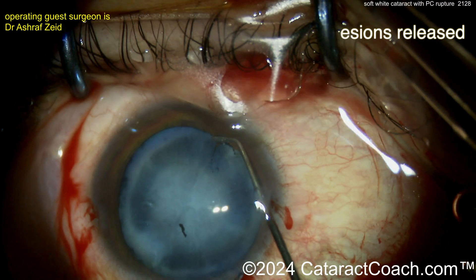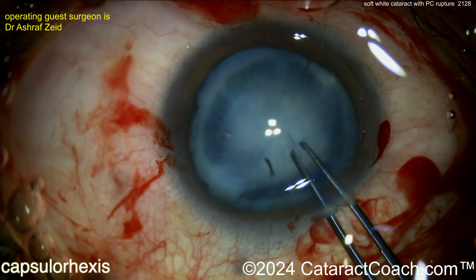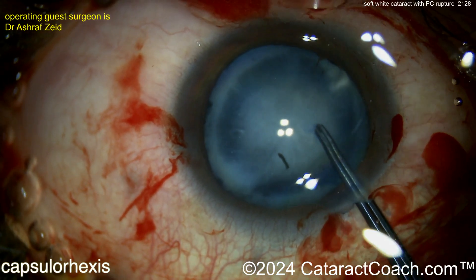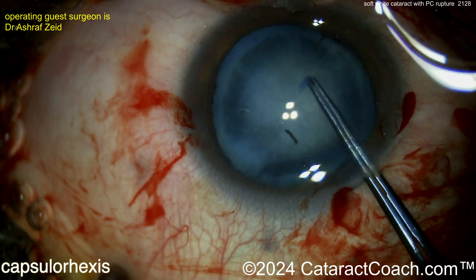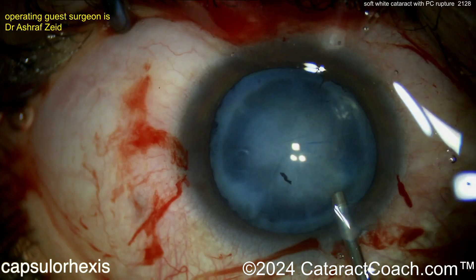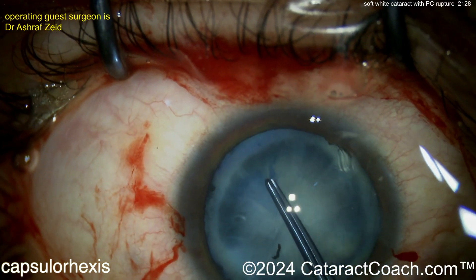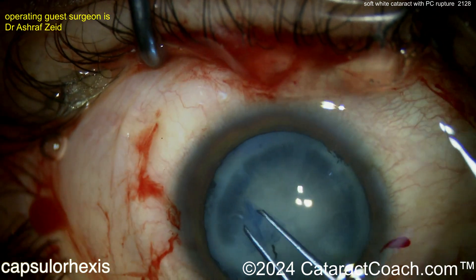This traumatic cataract has a lot of opacity on the core material but not a lot of nuclear density. Now the rhexis is done — watch carefully to make sure there are no signs of zonular weakness as you create the rhexis. This patient sustained some sort of injury to the eye, and you can see the rhexis is being completed — that looks pretty good, a nice complete rhexis.